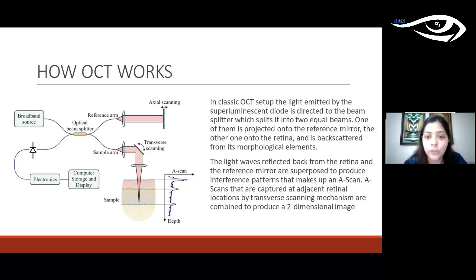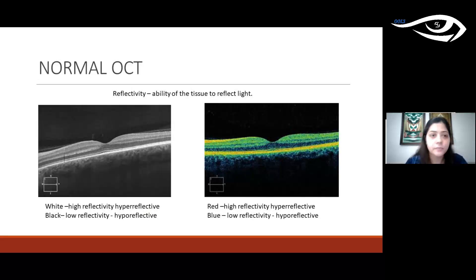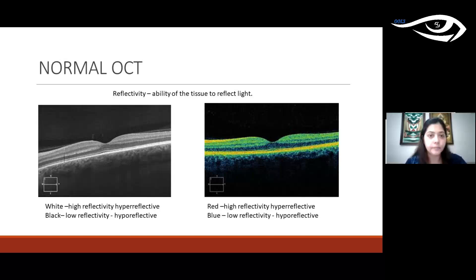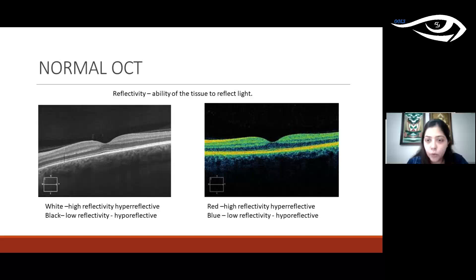A-scans are captured at adjacent retinal locations and combined to give a B-scan. On a normal OCT, the dark area above corresponds to the vitreous, the alternate black and white lines constitute the retina, and below is the choroid. White areas are called hyper-reflective because they have high reflectivity; darker areas have lower reflectivity. In a color image, blue corresponds to lower reflectivity and red to higher reflectivity.